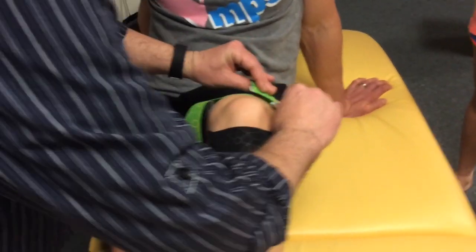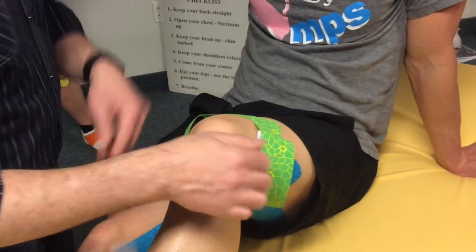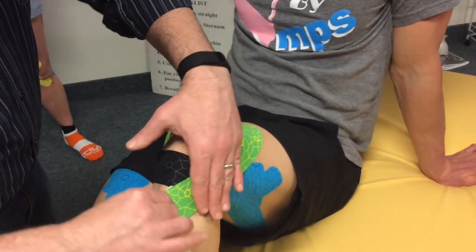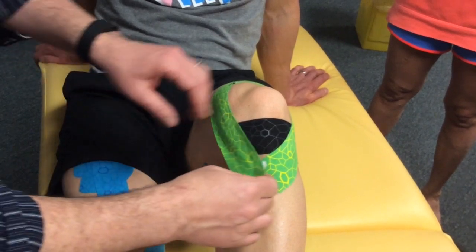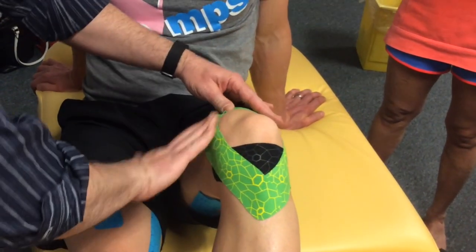Once the anchors are in place, peel the backing away of one I-strip exposing the adhesive, but leaving just enough for the other anchor to be covered for easy handling. Stretch the tape from proximal to distal with about 25 percent stretch on both I-strips, running the tape along the lateral and medial aspects of the knee, anchoring the tape with no tension just below the inferior patellar tendon.